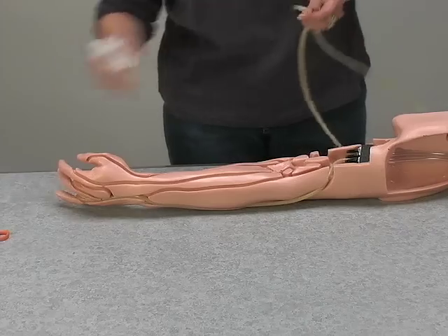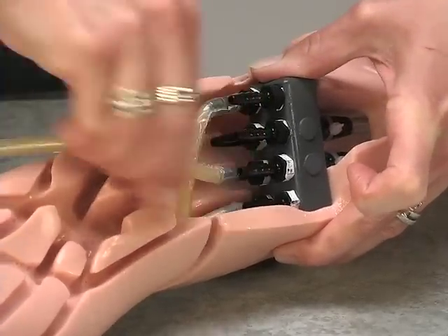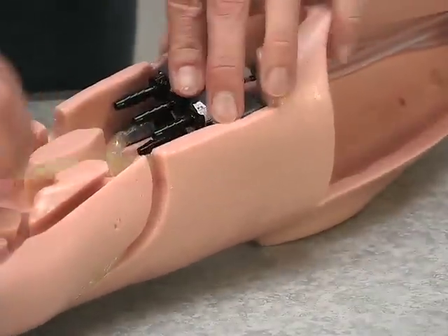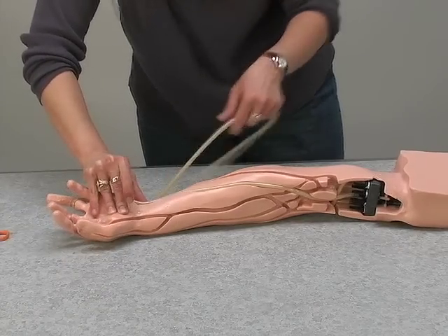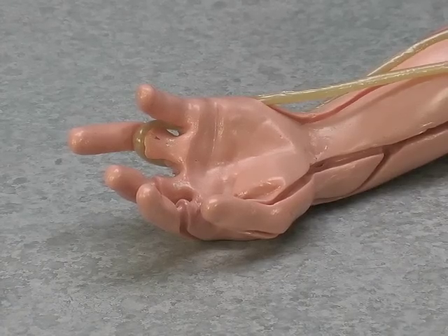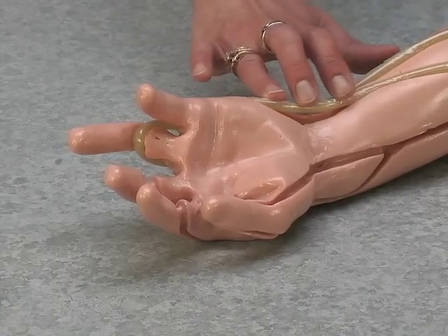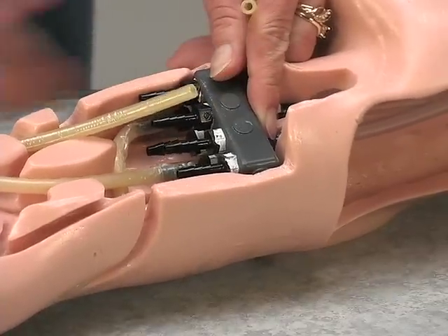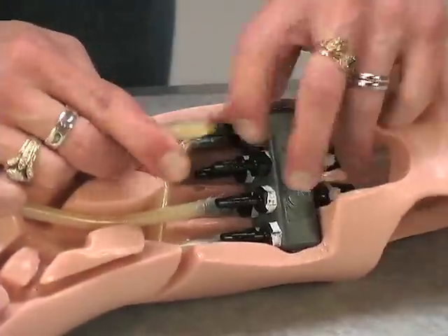Lubricate the loose end and connect to fitting number four. For the second vein, lubricate and connect to fitting number two. Press the tubing into the channel, around the loop near the wrist, and back to the connector block. The tubing may be loose around the wrist — it easily slides back into the channel and will not be a problem for installing the replacement skin. Cut the end of the vein to fit, lubricate, and connect to fitting number three.